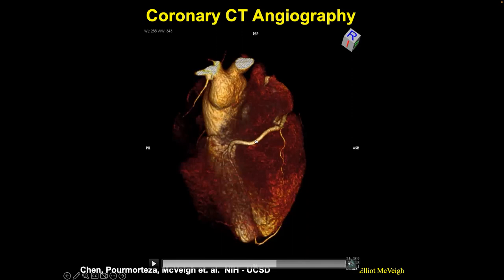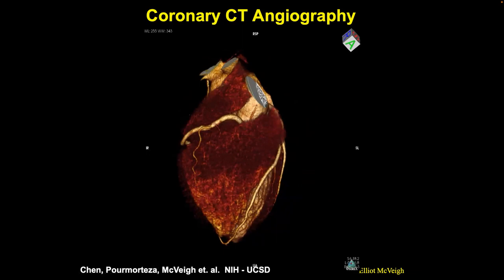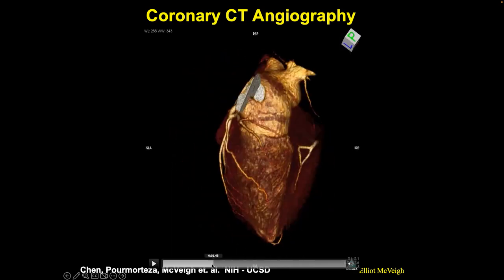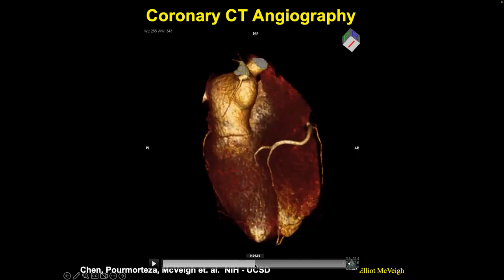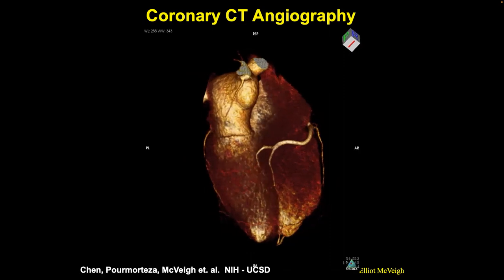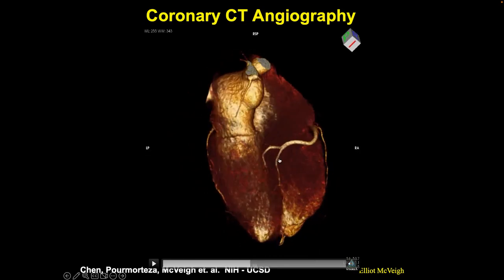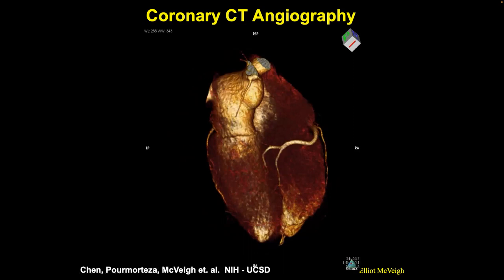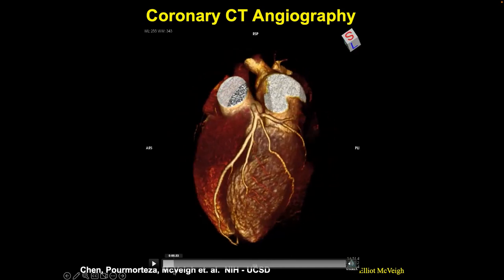You can see a very clear depiction of the right coronary artery — four to five millimeters in diameter — with a branch running down onto the surface of the right ventricle. As we go around, the right coronary artery in this patient is the dominant vessel feeding the posterior wall. A large lesion there would result in loss of the posterior wall, visible as a dark spot on the bottom of the heart in a perfusion scan.